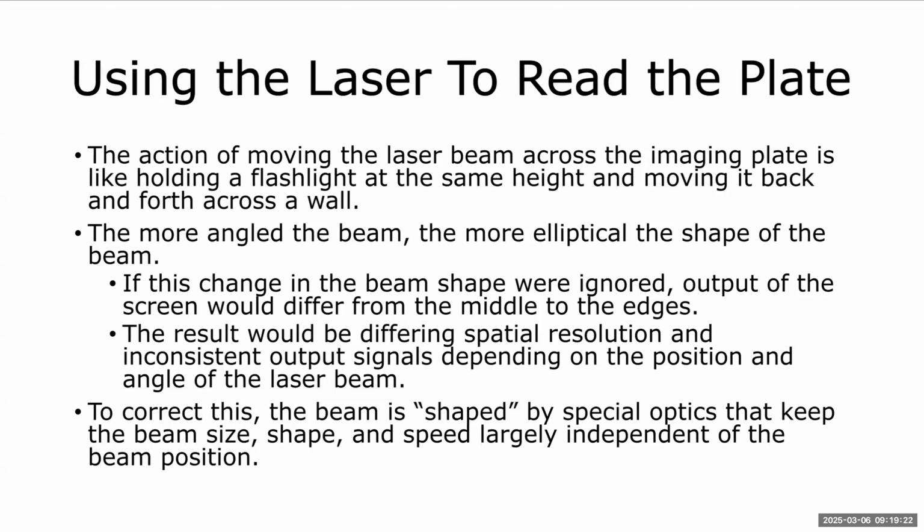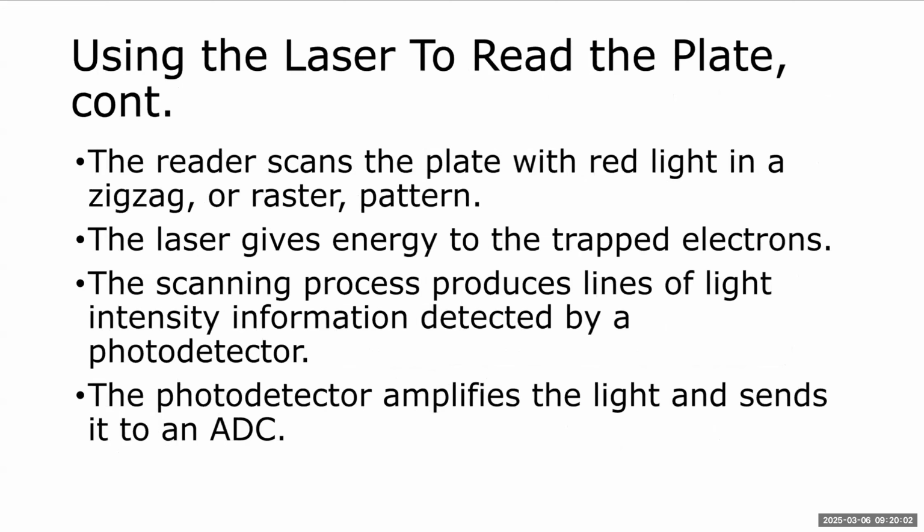I'm not going to take a whole lot of time on this. I'm hoping that the registry is moving more away from some of this CR technology because it is sort of going by the wayside. But the laser would move across the imaging plate, sort of like holding a flashlight. With the optics, you wanted to keep the beam size, the shape, and the speed the same, so that every part of the plate was looked at the same way, so that you didn't get different outputs or different spatial resolutions. You wanted that to be consistent.